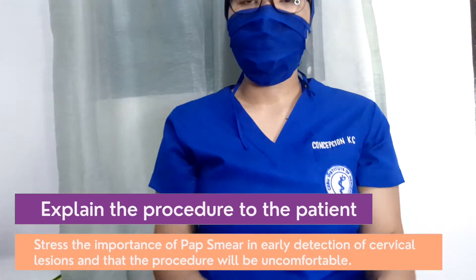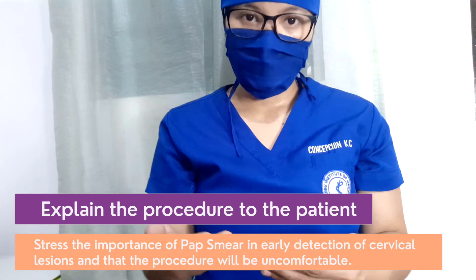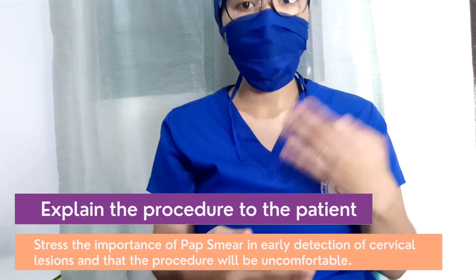Explain the procedure to the patient. Stress the importance of PAP smear in early detection of cervical lesions and that the procedure may be uncomfortable.